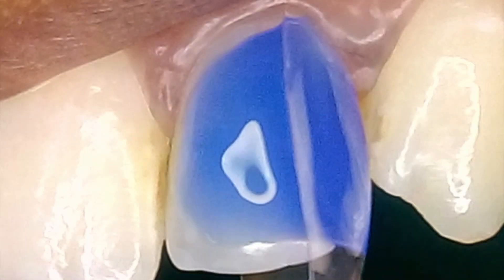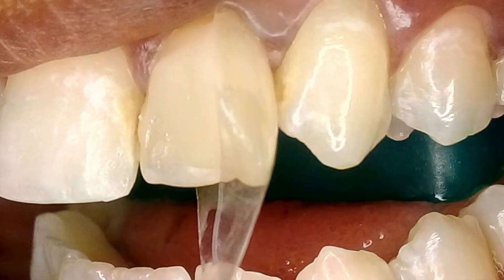With the matrix in place, I next injected the etchant, washed it after 15 seconds, applied the bonding agent, and cured it. Then I injected an opaque A2 shade composite from Shofu. Notice the overfill and the spread of the composite over the enamel surface.